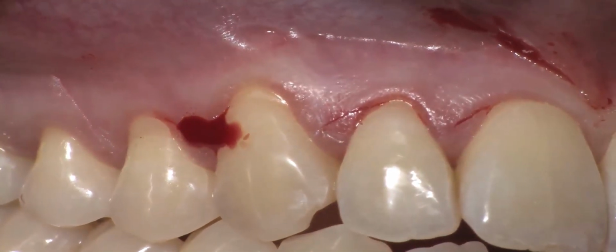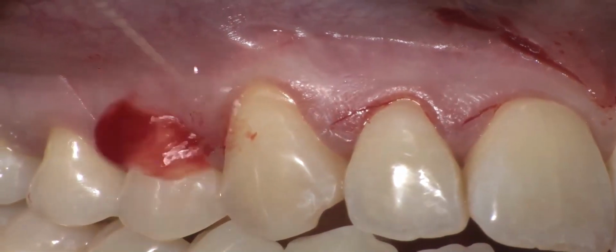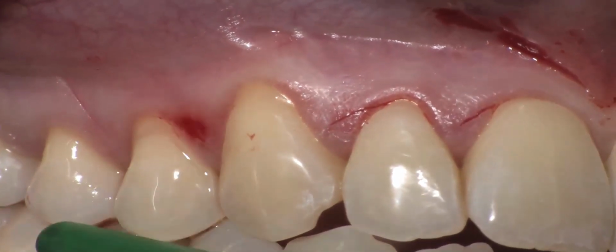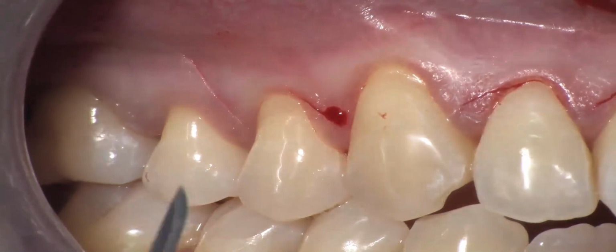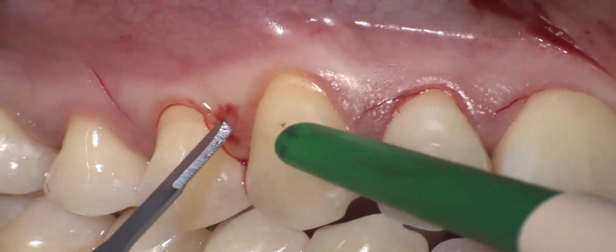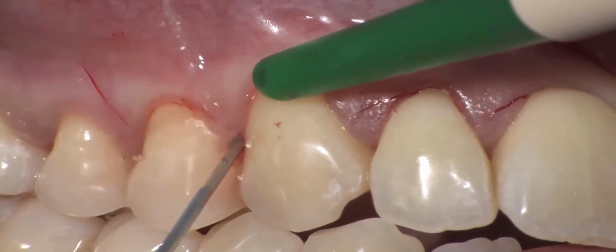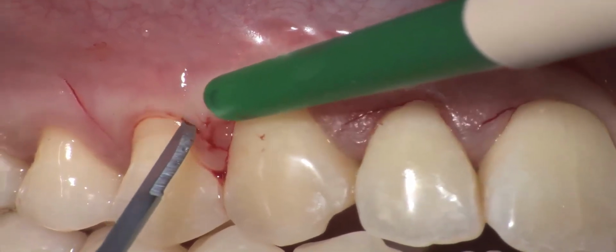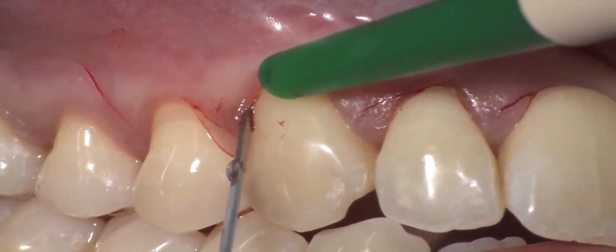distal to the premolar, which creates a triangular shaped papilla distal to the second premolar that has exactly the same shape of the anatomic papilla comprised between the two premolars. Now that the flap design has been made, I get in my incision line. I have to keep the integrity of the tip of this papilla by preserving an epithelium connective tissue layer.